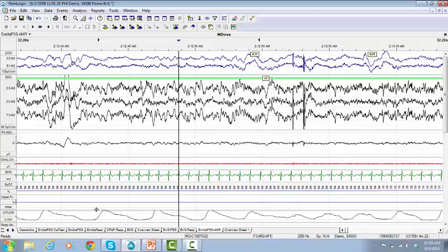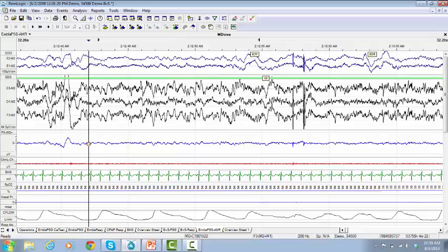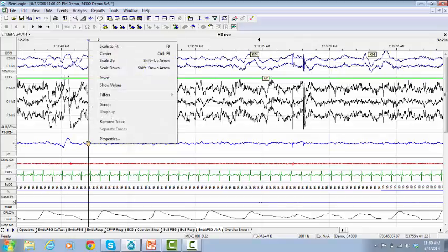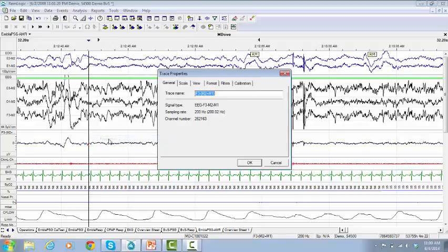If you want to change the color of the trace, activate the trace by left-clicking on it. It will be highlighted in blue. Right-click on the activated trace and select Properties.